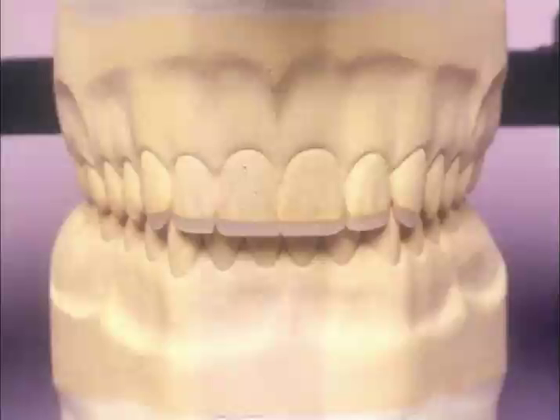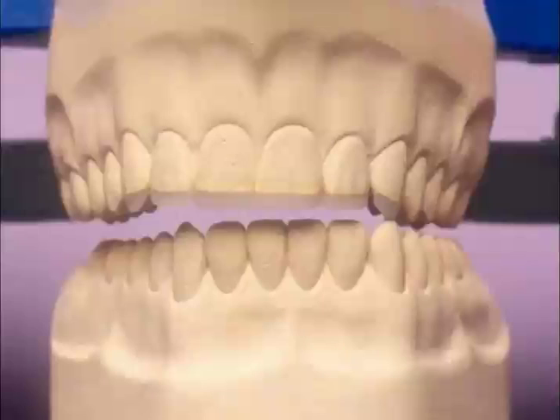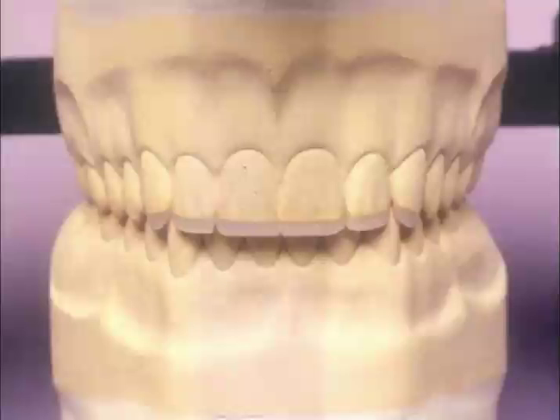So now we can evaluate the occlusion of this patient, the state of being closed. Do we have equal simultaneous contacts when the joint's in the fossa? We can also check the active closure, going from a protrusive position back into full occlusion, or left lateral movement back into full occlusion, or right lateral movement back into full occlusion with no interferences of the teeth.